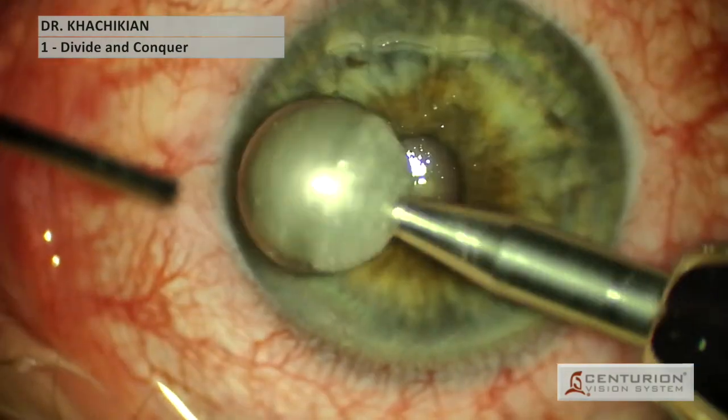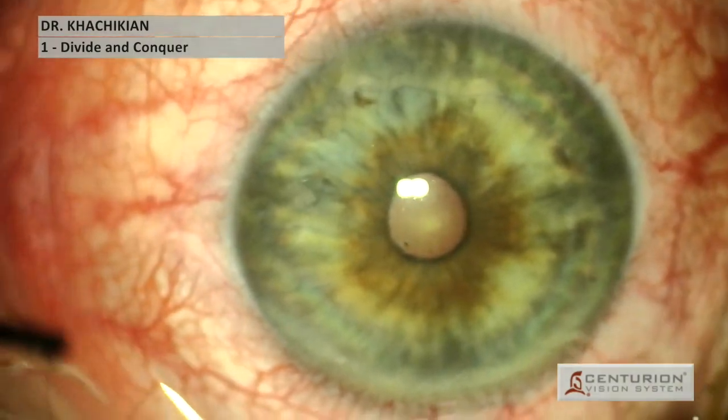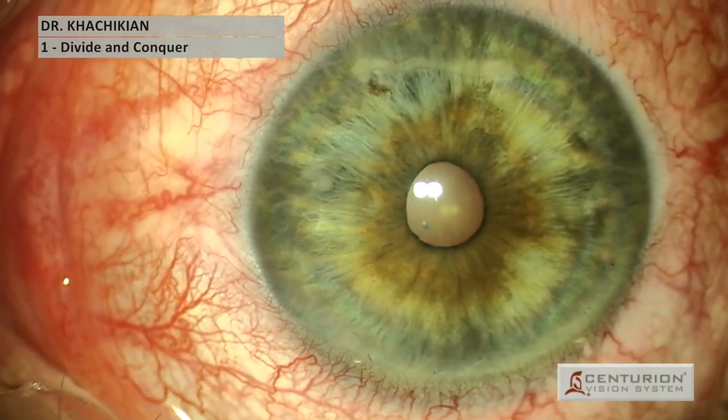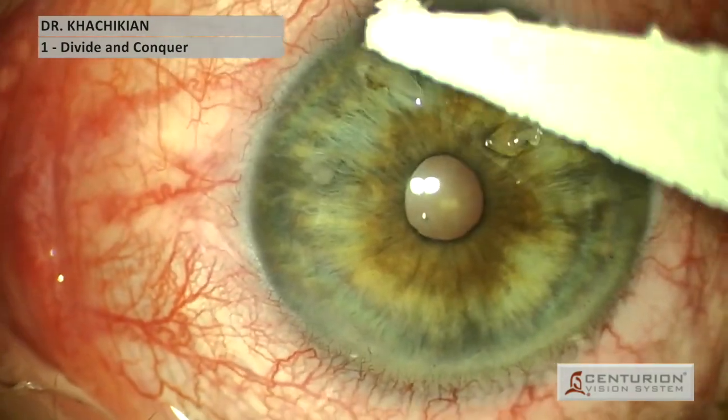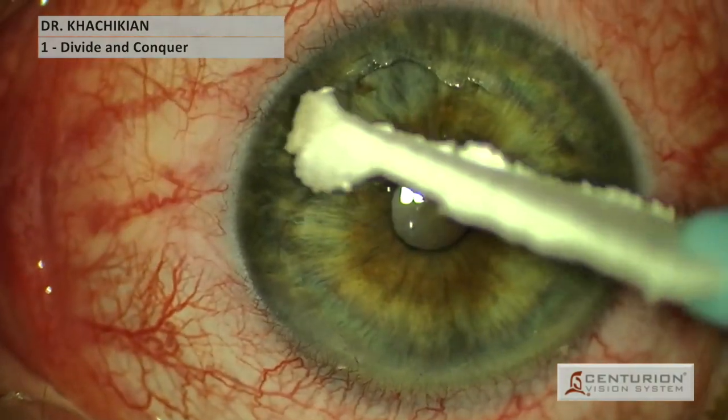Here we are again, just diamond burr polishing gently around the visual axis. We may do a little bit right in the center of the visual axis, but only lightly, to ensure that the epithelium heals down as it regrows.